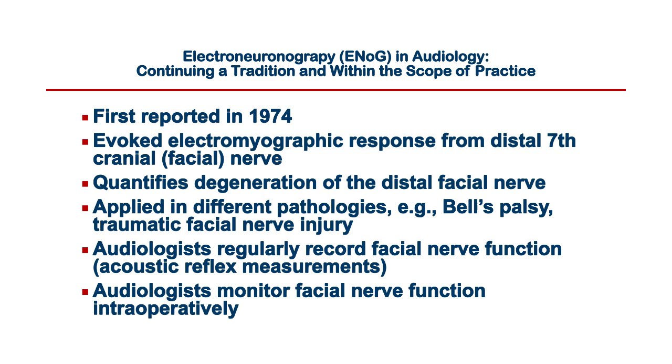And because I had been working in the neuro-intensive care unit with neurosurgery and some anesthesiologists already at that point, this was the early to mid 1980s, there was a big trauma center there at the University of Texas Medical School. I had equipment that not only could perform auditory evoked responses, but it also had the option for electrical stimulation. So this equipment could be used to record both somatosensory evoked responses, which we'll discuss in another PowerPoint, but also it turns out it could be used to stimulate the facial nerve and record ENoG.